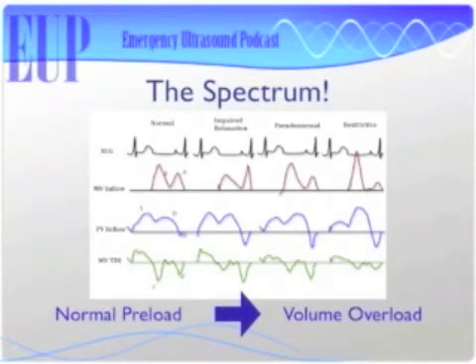So I think you can pretty much hang your hat on when the IVC is collapsible, you give the patient fluid. You give them a fluid bolus and see how they respond, right? The patients that I'm more interested in are the patients who have a bigger IVC, and I want to know, do I need to give them pressors? Should I continue trying fluids? Because it's not always just clear based on your IVC, right? I mean, you give them some pressors and you keep going with the pressors and they're not responding, you're thinking, well, maybe I should give them fluid, right? The question for me more becomes, at what point do I start dobutamine on these patients? At what point do I try to push their heart a little bit more? At what point do I stop giving them fluid?